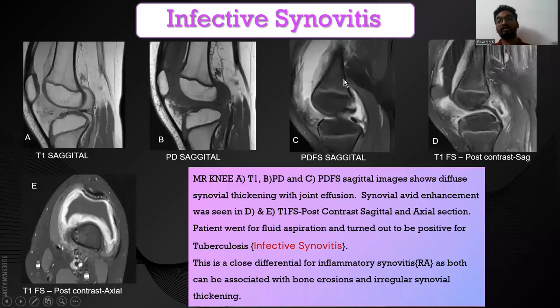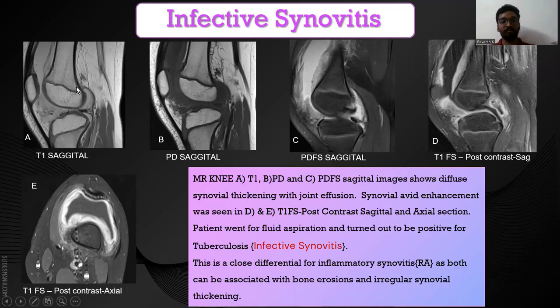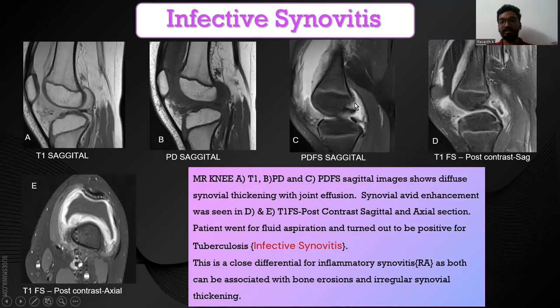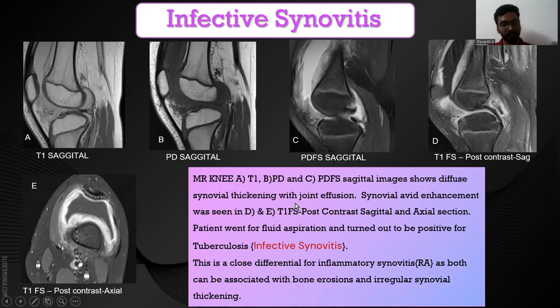A close differential for rheumatoid arthritis is infective synovitis. In this patient — a child who came with knee pain and swelling — on T1 sagittal, PD sagittal, and PDFS sagittal, joint effusion was seen associated with diffuse synovial thickening. On post-contrast images, diffuse synovial enhancement was seen, more evident on axial scans, which is consistent with infective synovitis.